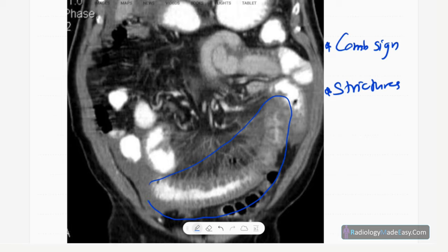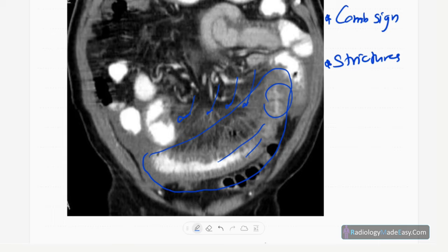Here again there is bowel wall thickening and narrowing of the bowel lumen — stricture formation — along with venous congestion and prominent mesenteric veins. This is another example of Crohn's disease on CT.